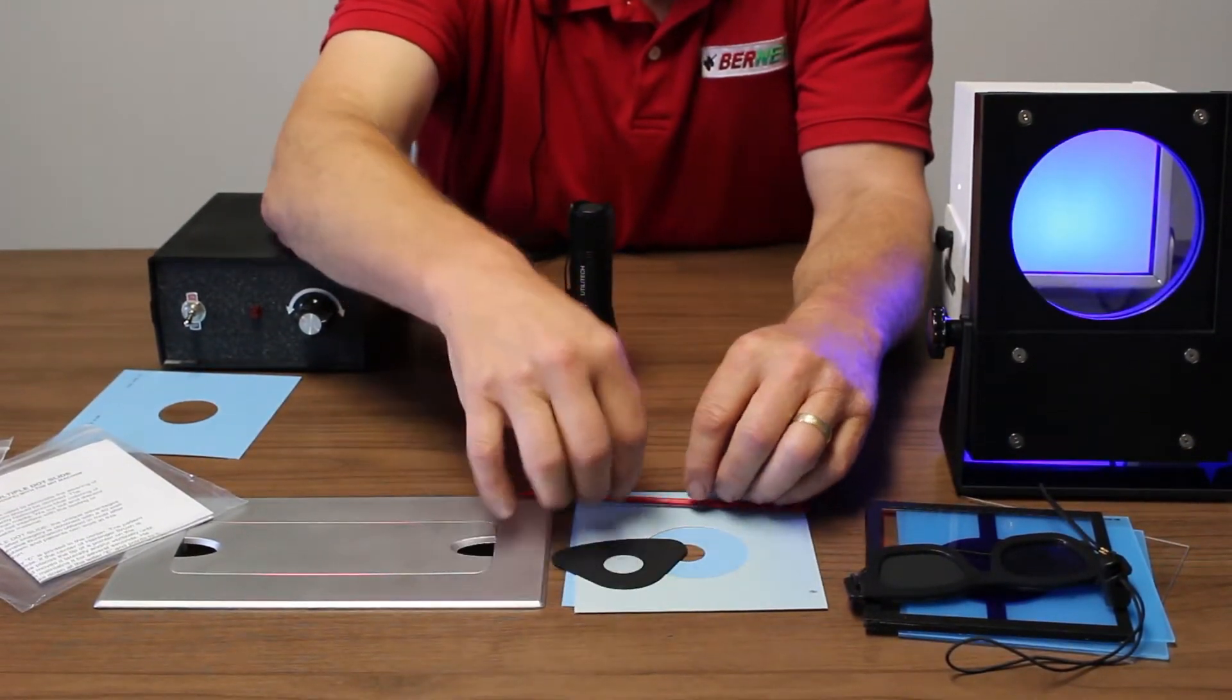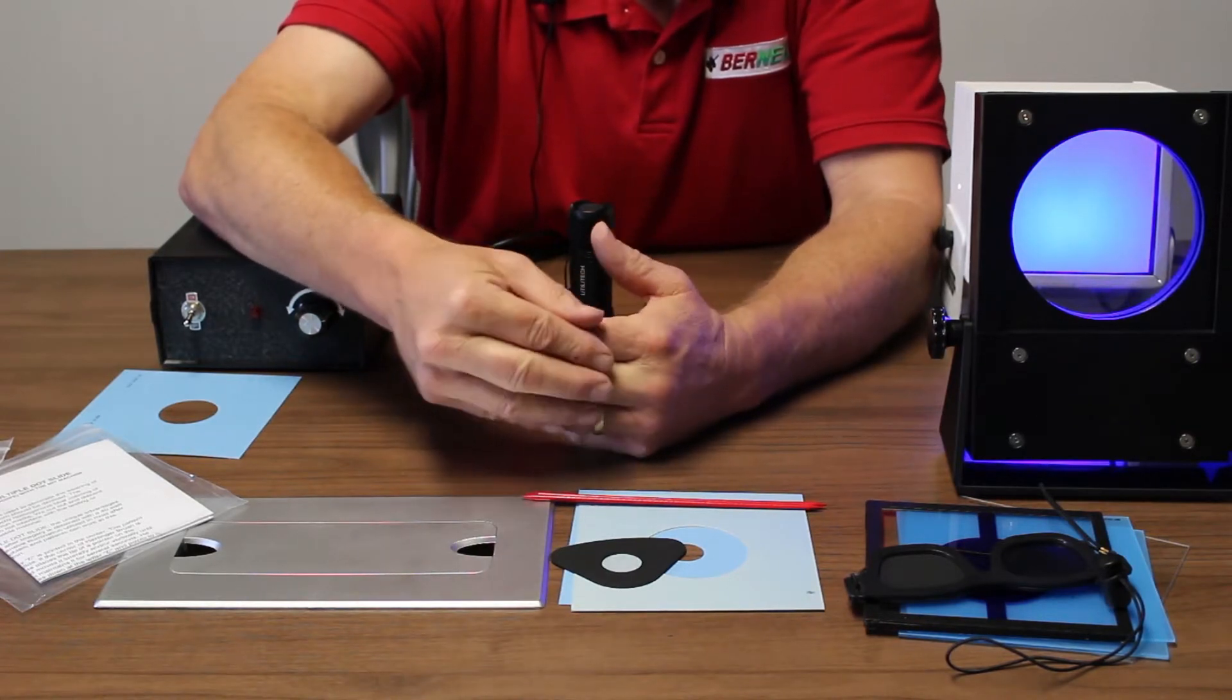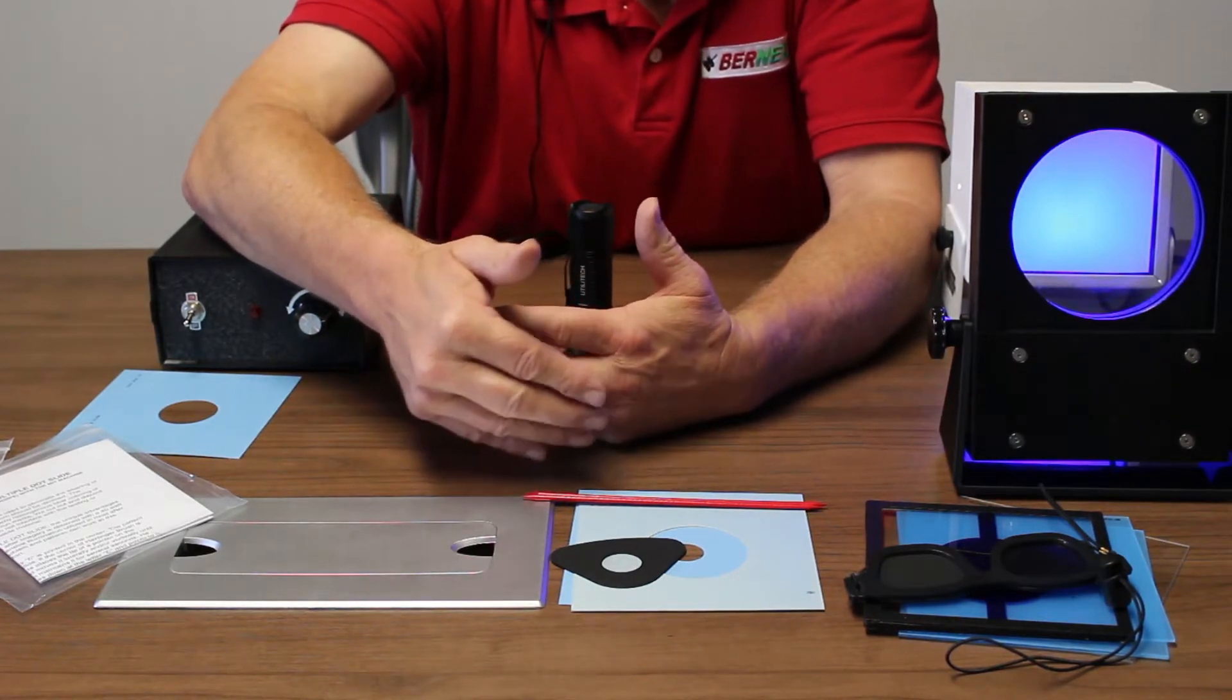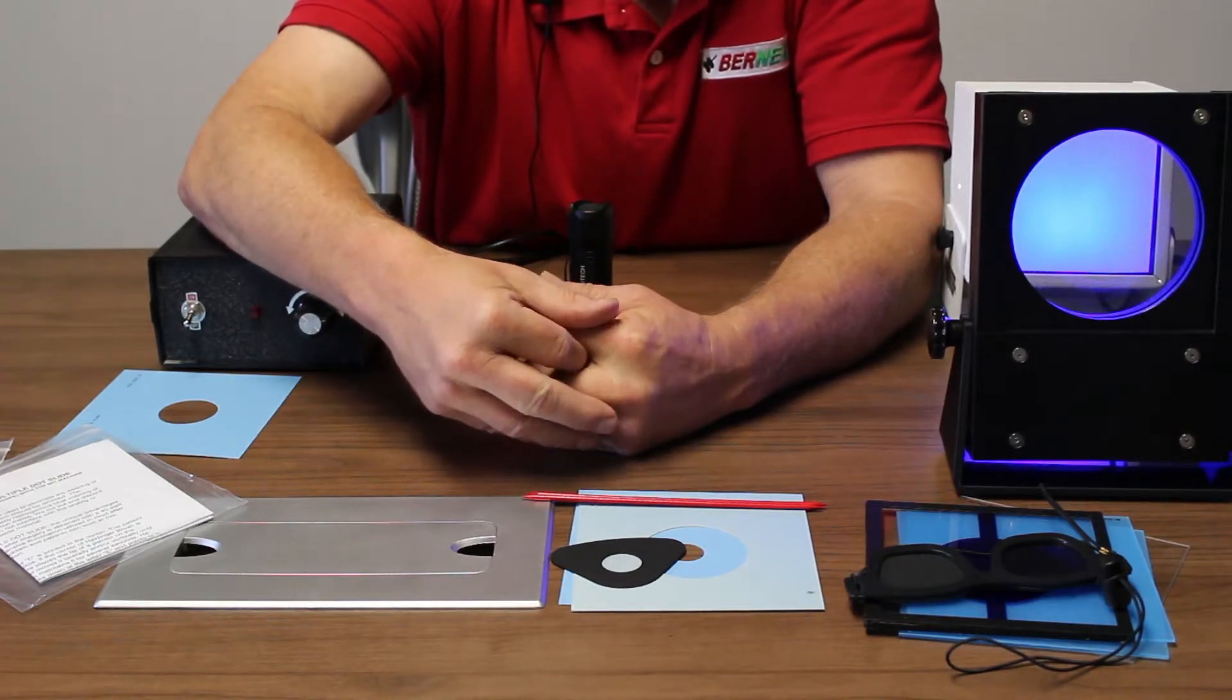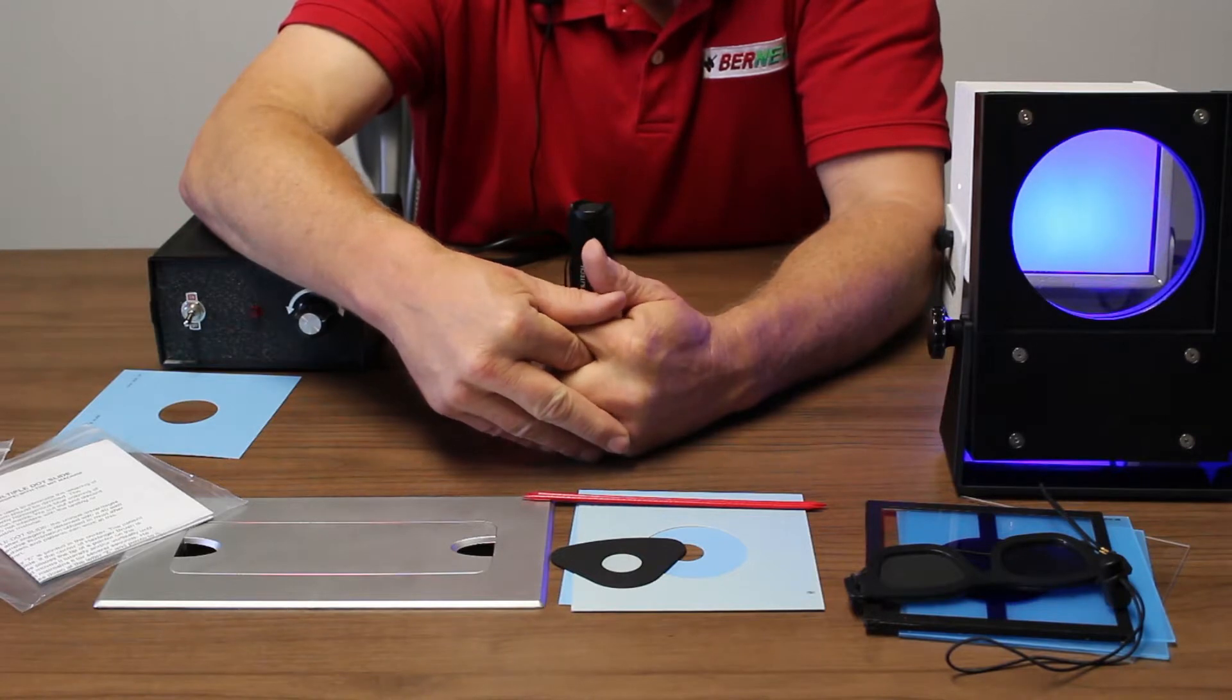This is a difficult technique. This is one that takes a while to learn the technique. It takes a while to make sure that you understand what the patient's telling you. But it is the only way to improve vision on an eye that has eccentric fixation.